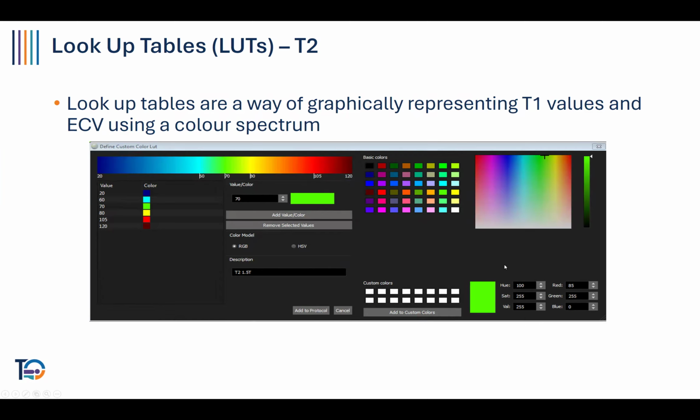Our T2s come from yet another table from a paper by Springcart in JCMR in 2015 and look like this, again going from cool to hot.